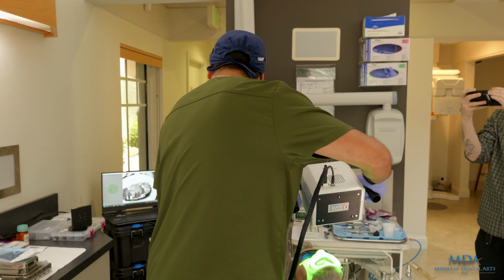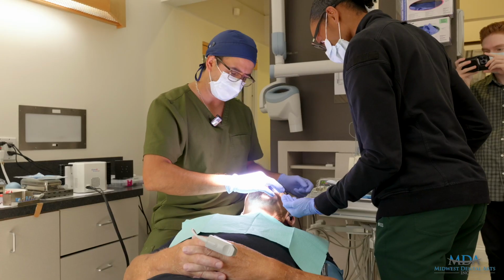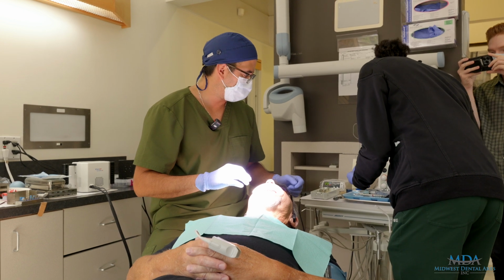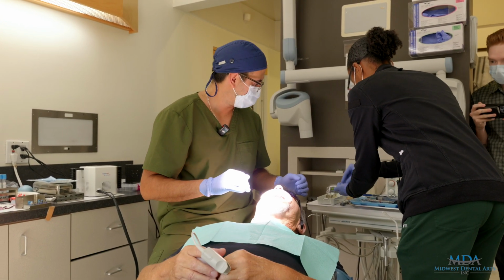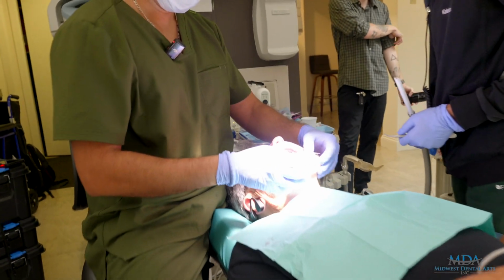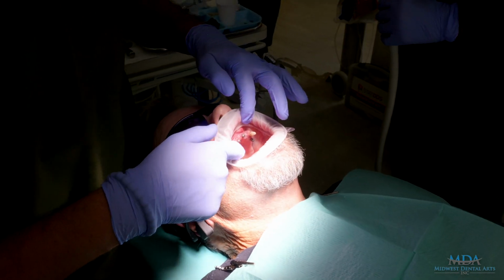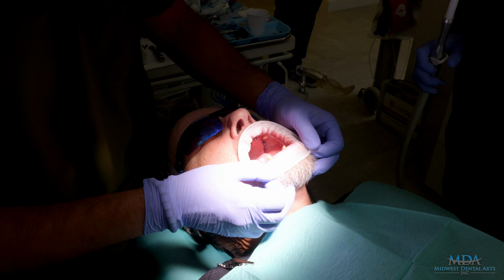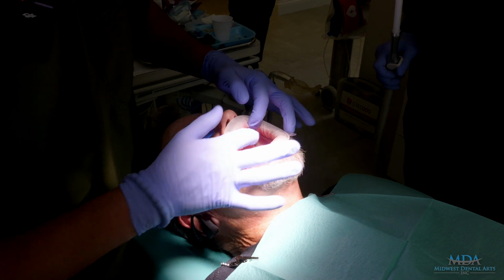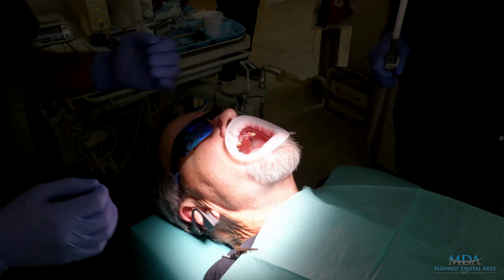There we go. Right there's perfect. And that's it. 4 implants. All right. And now we're gonna go back with the healing caps, and then we're gonna do tissue scans, and then we're done. Now, here, if you come look, we have the teeth still in place that need to be extracted. We have the biomarkers or scan bodies for our tissue scans. So all we need to do now is just get a nice upper and lower scan, and with that we can start our design.